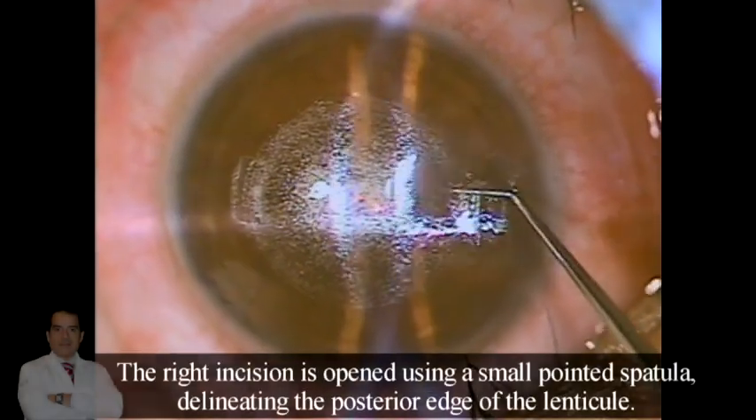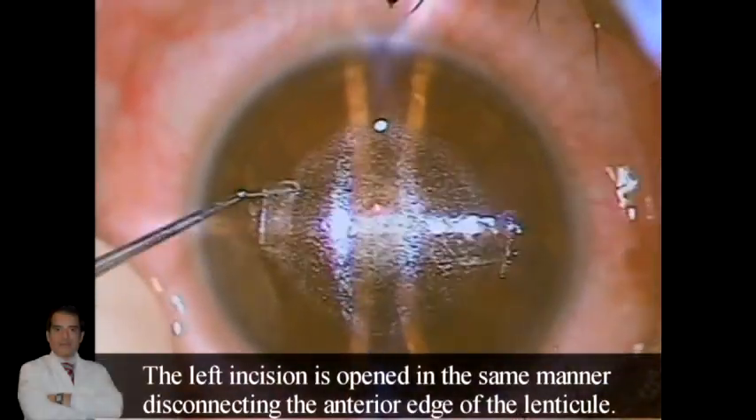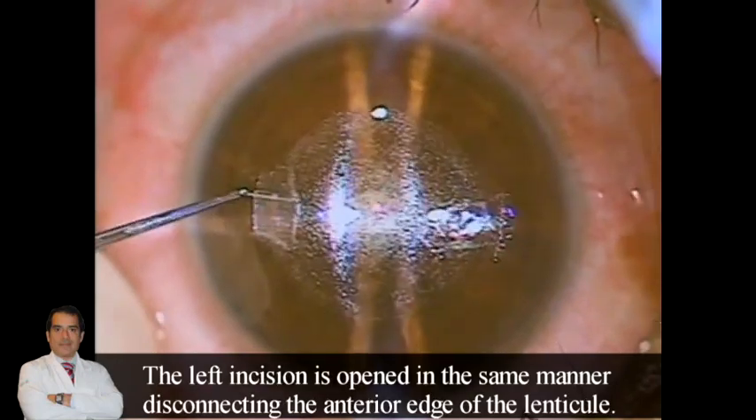The right incision is opened using a small point spatula, delineating the posterior edge of the lenticle. The left incision is opened in the same manner, disconnecting the anterior edge of the lenticle.